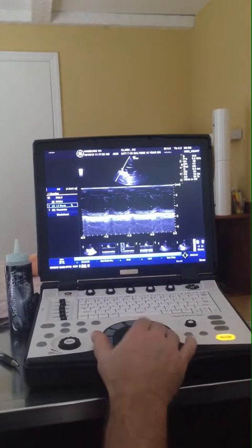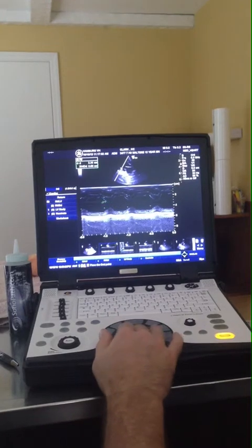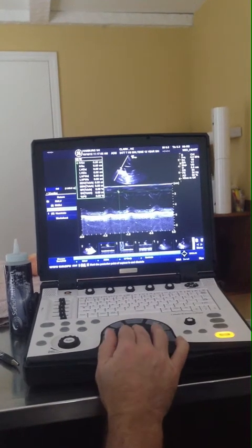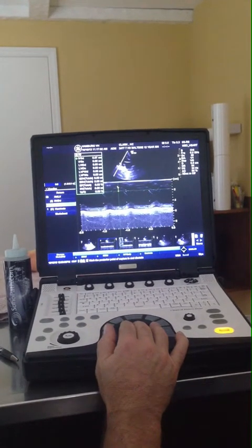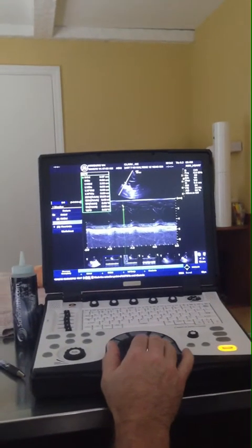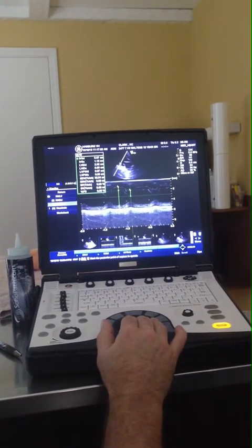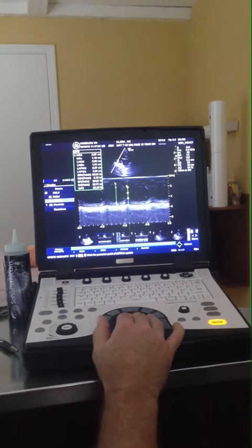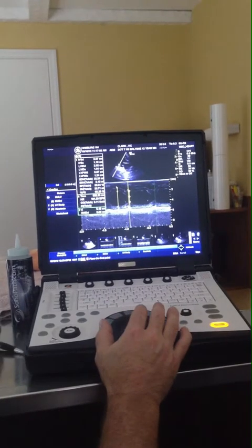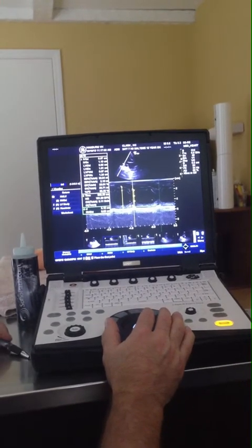LV study again. Diastole: septum in the near field, leading edge to leading edge, internal diameter, free wall. Then systolic septum, internal diameter, free wall. Peak to peak. This time IVSD and FWD are both 0.67 — that's actually better, so I'll take this one and report it out.